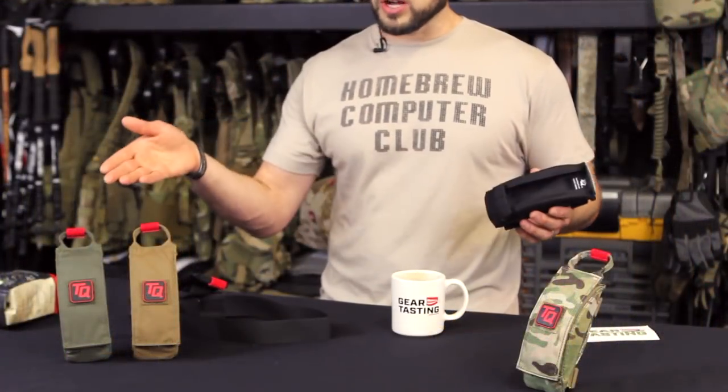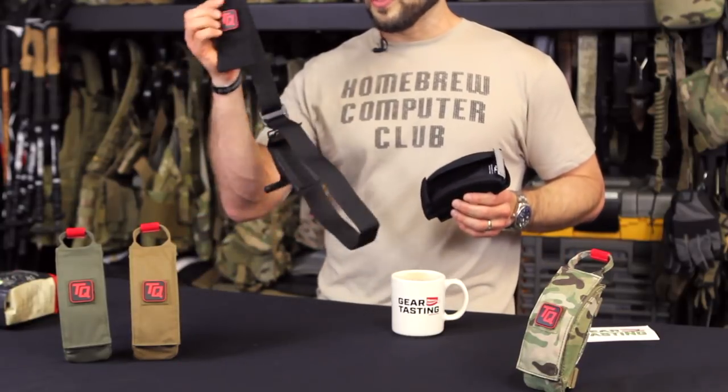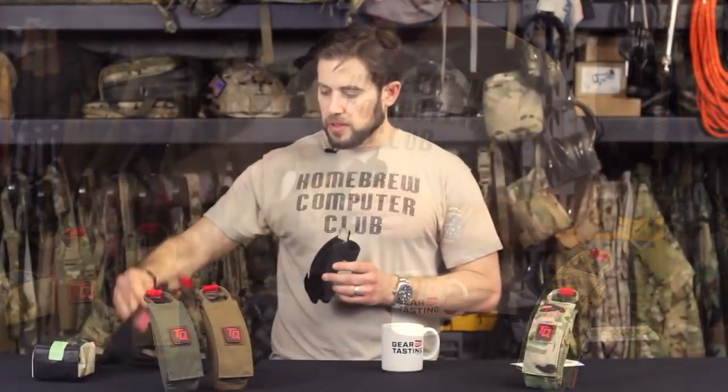Very versatile. It now comes in Ranger Green, Coyote, Multicam, and of course black, with the new PVC patch on the front. That is the big news for today, and moving on with the questions.